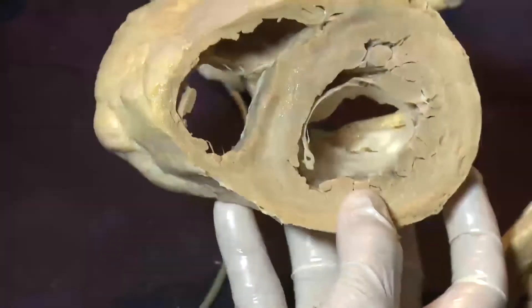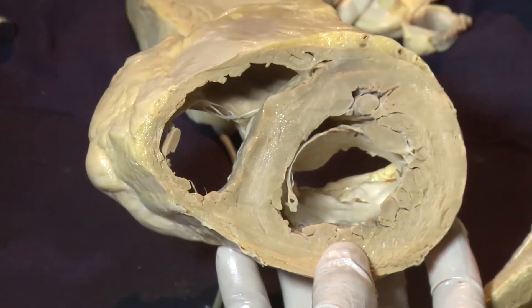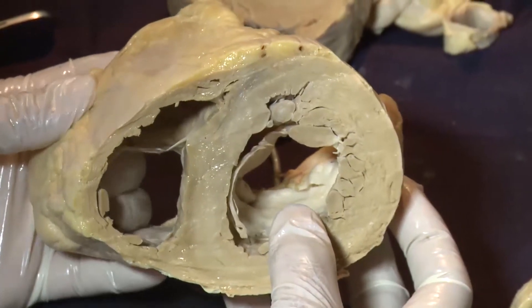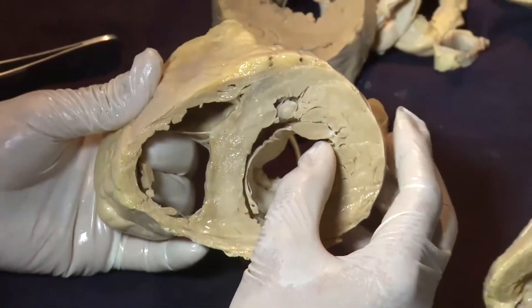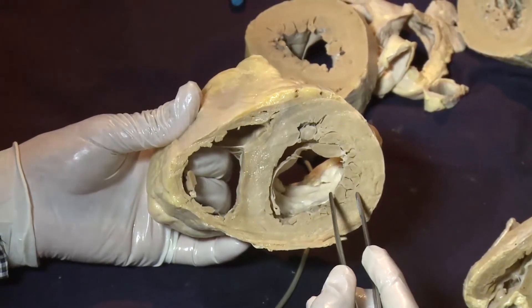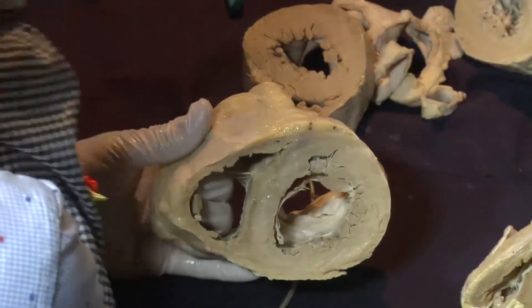From a clinical point of view, when we initially saw the echo it looked thin-walled and dilated, but now we actually see that the patient has hypertrophy. Are you able to discern if the heart comes out with thin dilated walls? Is that more common in familial dilated myopathies? I don't see thinning of myocardium, even in dilated cardiomyopathy. More often, it is rather unusual for it to become thicker than usual, but usually the thickness of septum and free wall of the left ventricle remains the same, because hypertrophy and dilatation come together. Maybe it will be different between the diastolic and systolic phase.